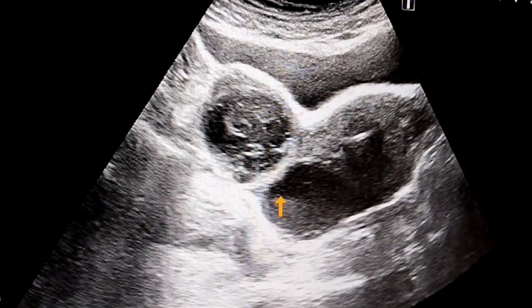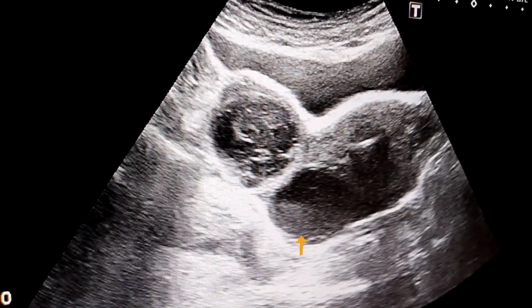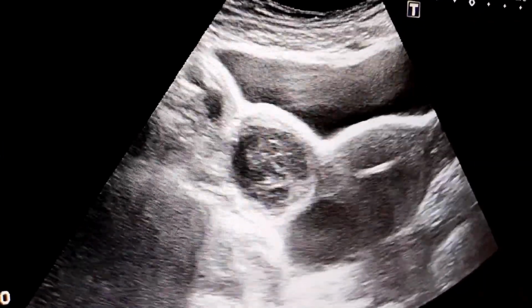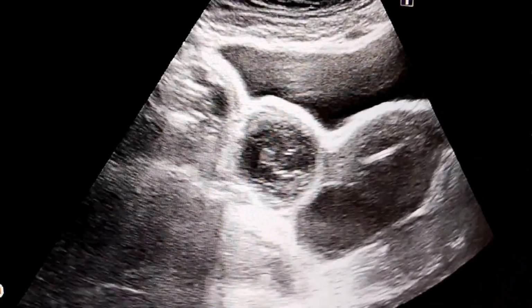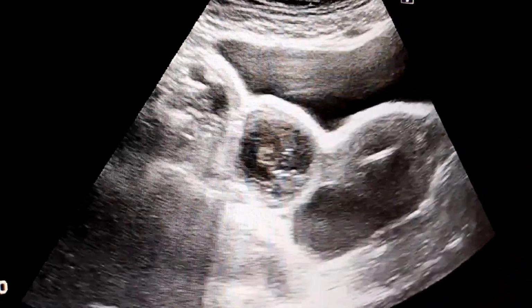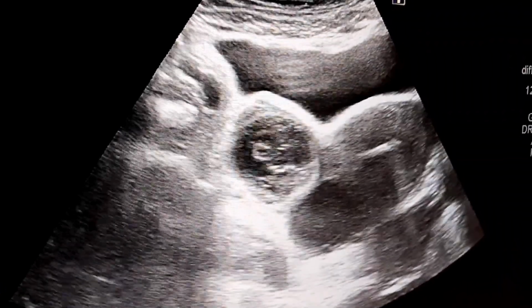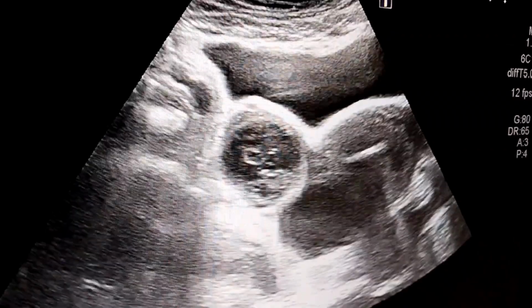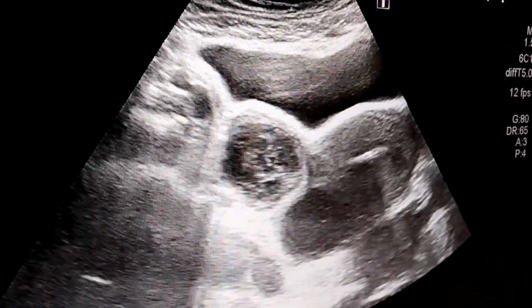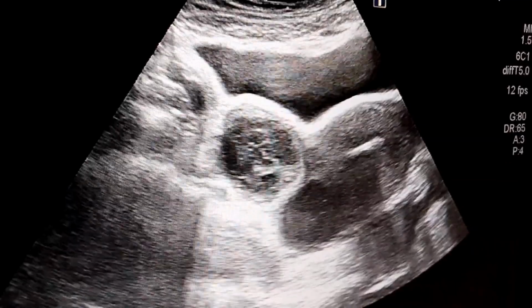So at the same time, in one patient, we have seen two cystic lesions, and these are showing the characteristic sonographic findings of hemorrhagic cyst. If we talk about the differential, we can also say that it may be the endometrioma or chocolate cyst.